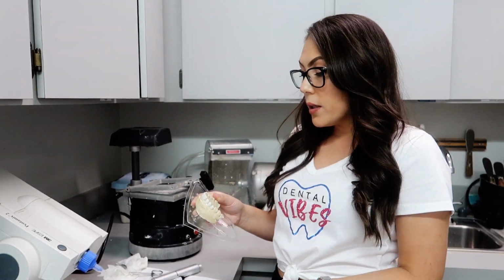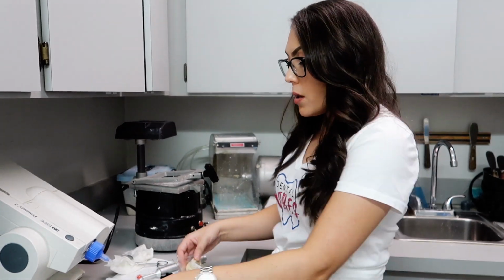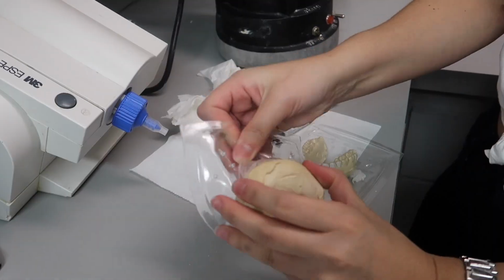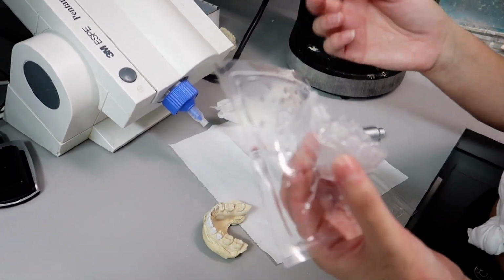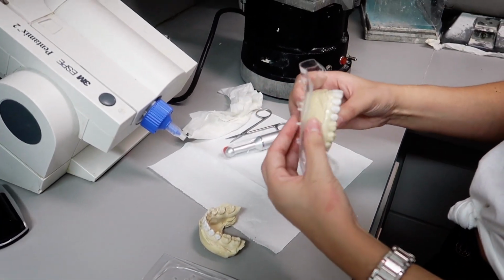I think I'm ready to go ahead and start trimming these trays. Now, one tip that I will give you: make sure that you wait for it to cool down, because if it's still warm and you try to rip this, you're going to make your trays loose, if not deformed. So you want to make sure it's cool, which they both are, and then you're just going to go ahead and take it off. Just like that. You see how if it was warm, it will lose a little bit of shape. So there we go. Let me go ahead and just take this one off. Wow.